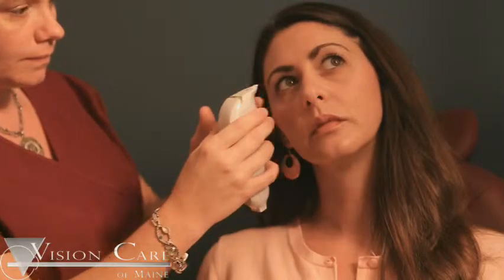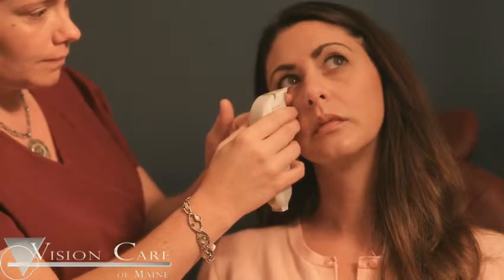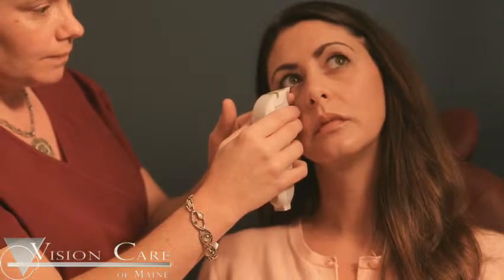Now we're going to measure your tears in order to determine whether or not a deficiency in tear is causing the symptoms that you're having. I'd like to have you tilt your head a little bit towards the right, look up towards the light. That's perfect. Now Mary is going to take this instrument and just touch it towards the edge of your lid, and this is going to get a sample of your tear. Just like that. Perfect.